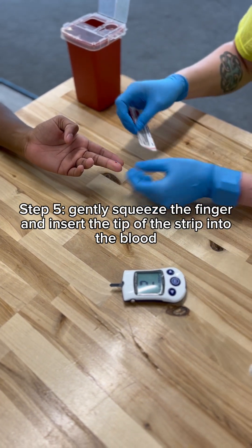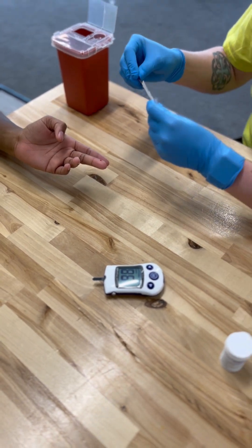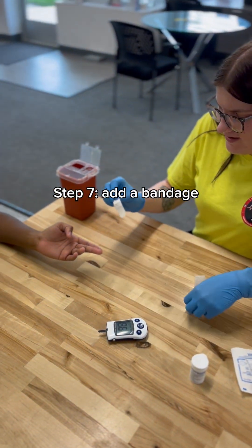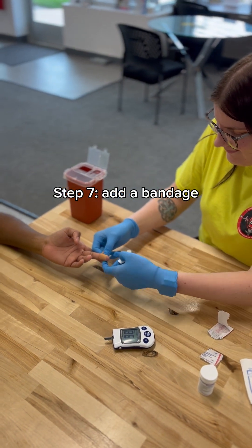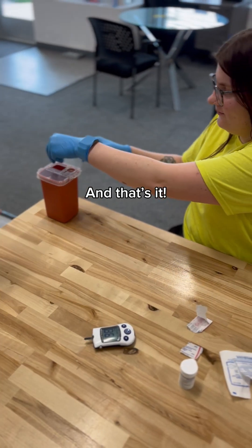And then it's going to count down for us. And her sugar was 98. Good job. And then we're going to put a band-aid on there. You're all done. Good job, thank you.